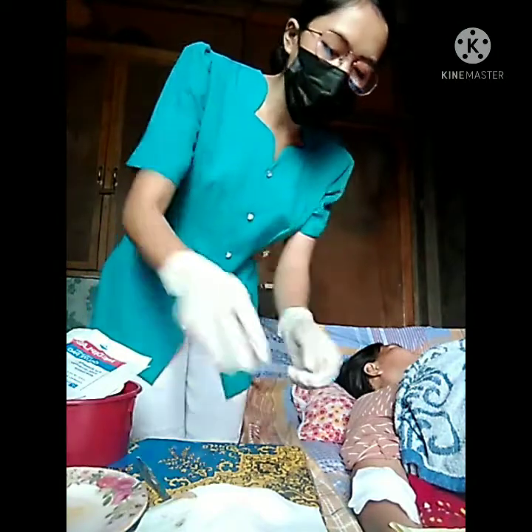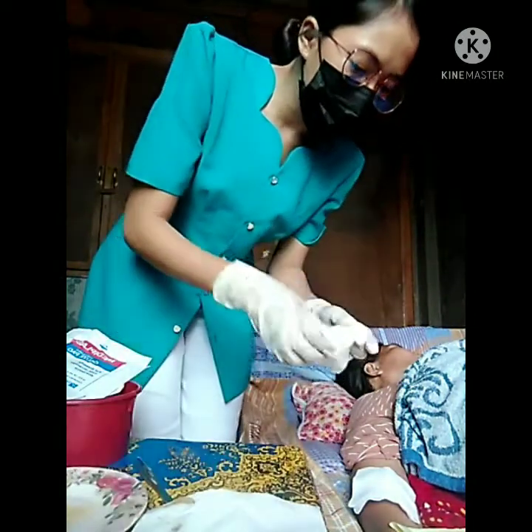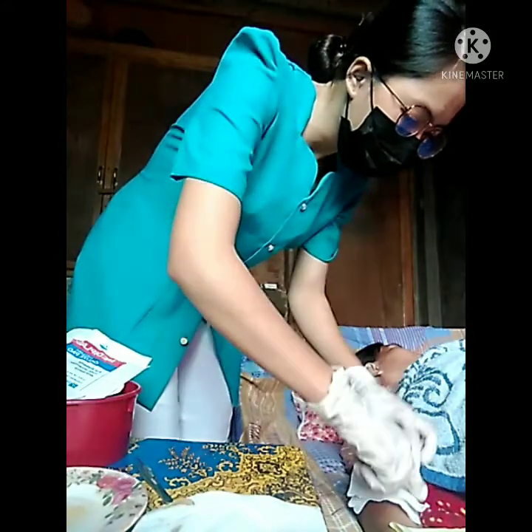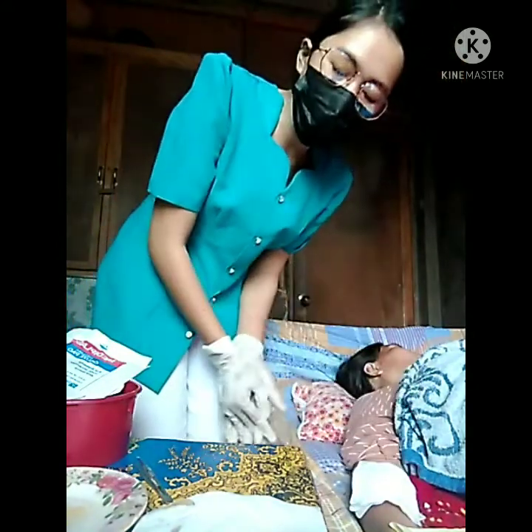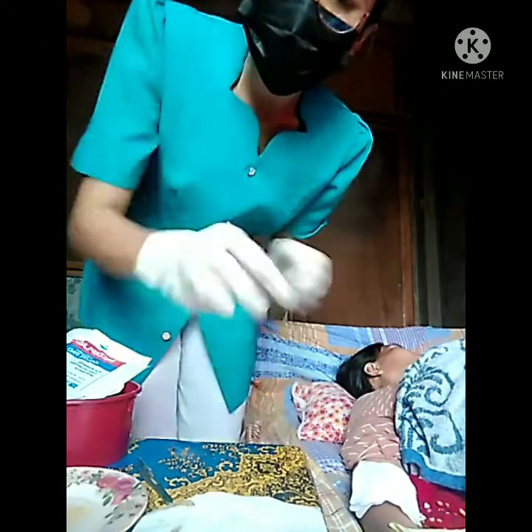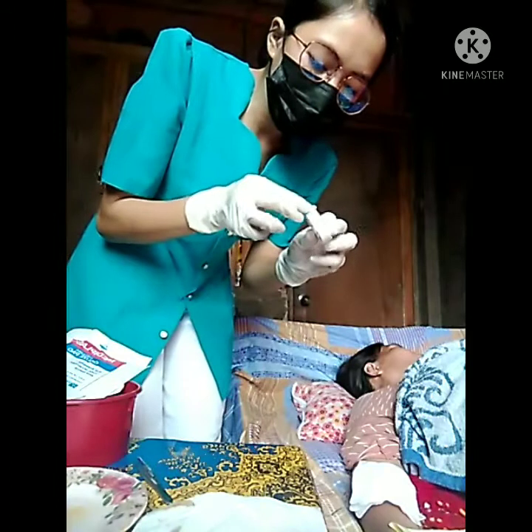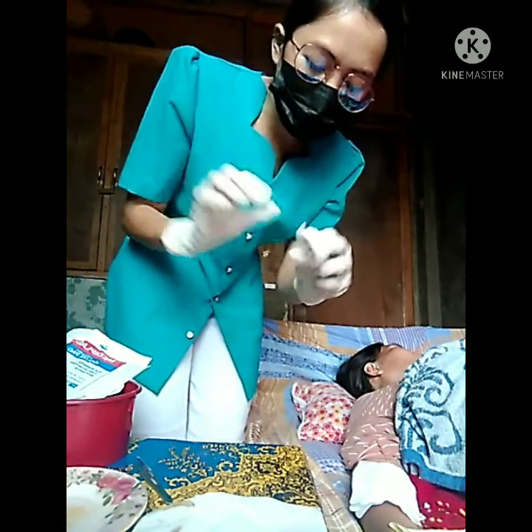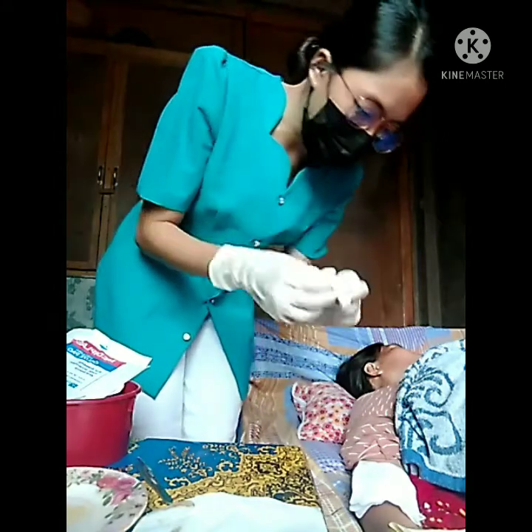And the next step is to apply the second layer of gauze. Then apply a thicker woven pad. Then put adhesive tape.